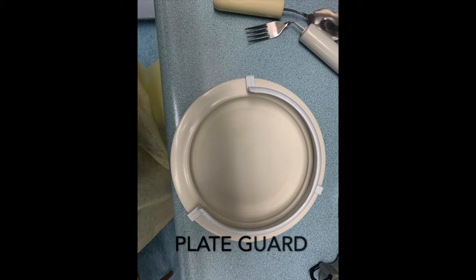The purpose of a plate guard is to create a high edge that helps food go onto the eating utensil and not off the plate and onto the table.